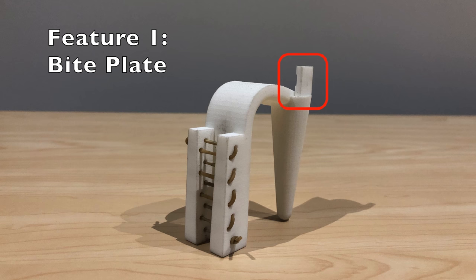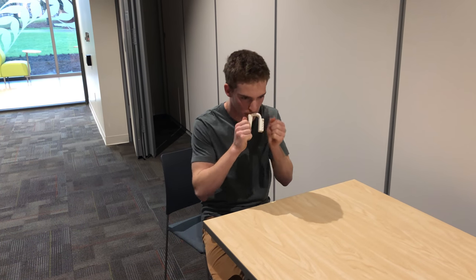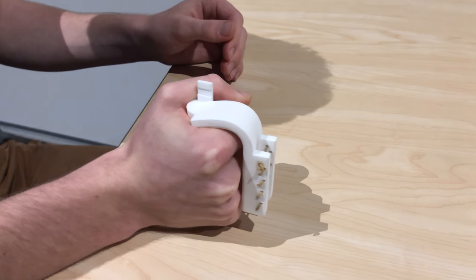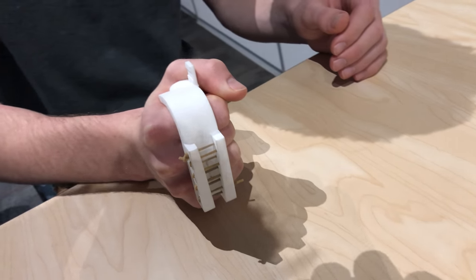The first feature is the bite plate. This allows the user to hold onto the device while they place it in their hand. The device has a tapered cone, which fits inside Ken's fists, which naturally has a tight grip. There's a curved arch on the outside, which closely fits his hand.